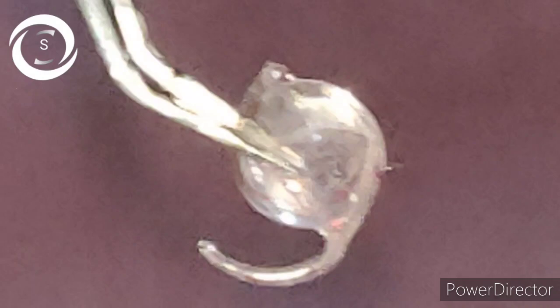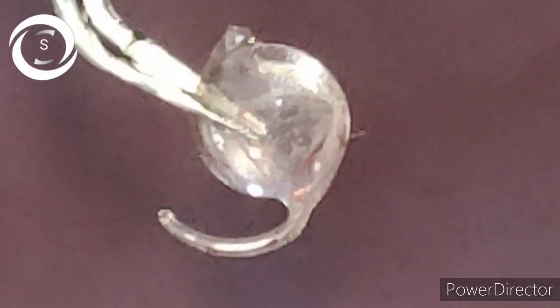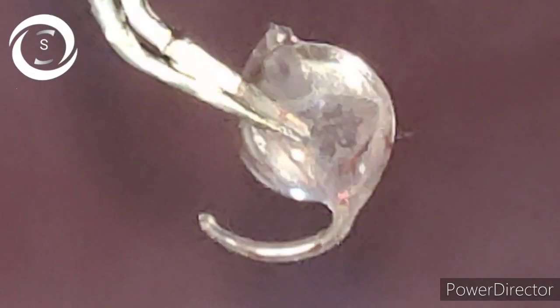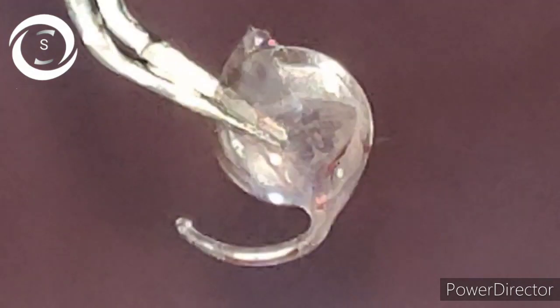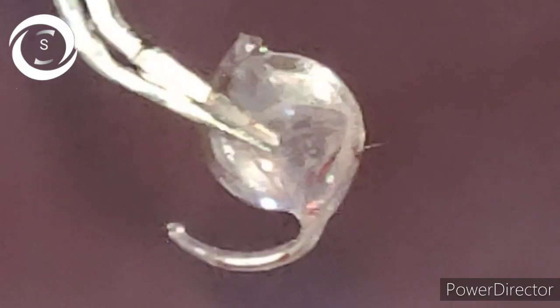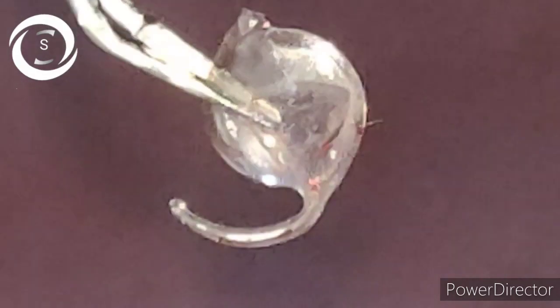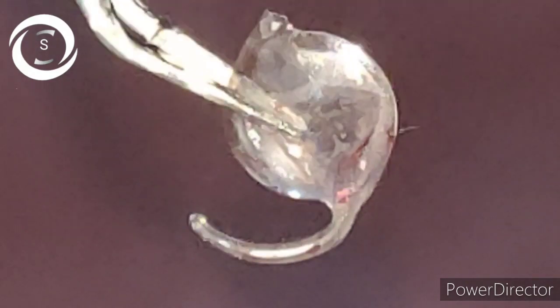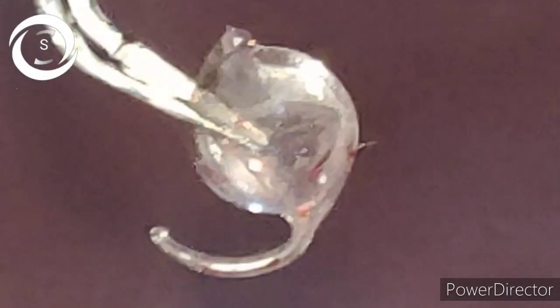Now let's come to today's case. As soon as I assessed that the haptic was broken at the optic-haptic junction, I did not place the IOL in the bag. I left it in the anterior chamber, enlarged the main port with a 5.2 faco knife, removed it in one piece, and replaced it with another full IOL.